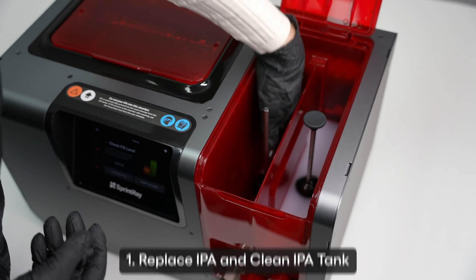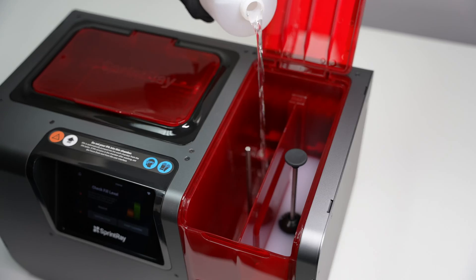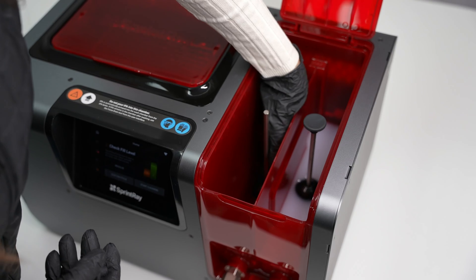To clean an IPA tank, remove the hydrometer. Scrub the tank with the provided brush, flush the tank with the IPA, then replace the hydrometer. Repeat this process with the other tank.